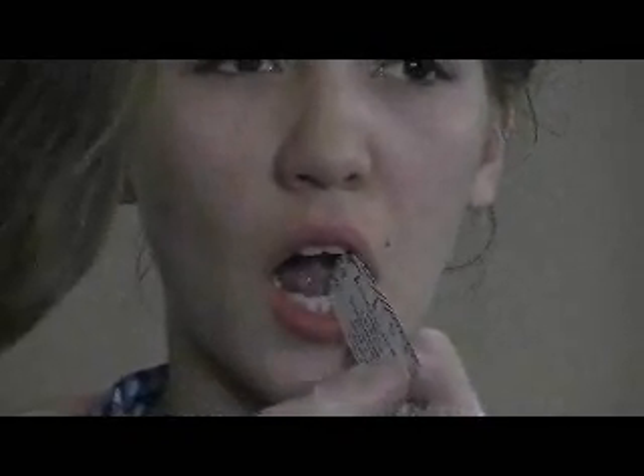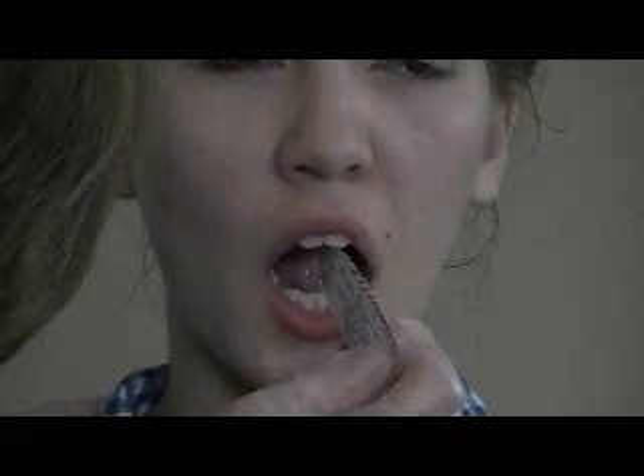Very nice. Now I want you to suction — we've been working a little bit on that — flat on the palate. Let's take that measurement. And that was a 24. I'm going to mark that down, and then we're going to watch how the 24 gets closer and closer to that first number.